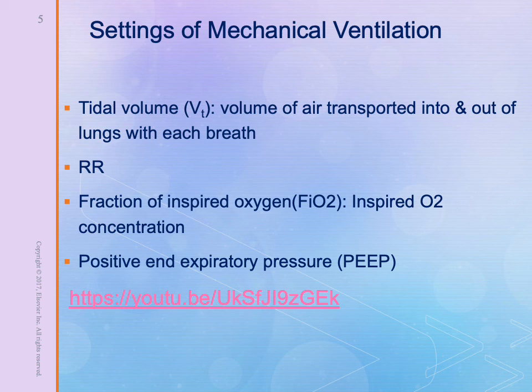The last setting that we will focus on is positive end expiratory pressure, or PEEP. It is the amount of positive pressure that is applied during exhalation, during the expiratory cycle, to keep the alveoli open and improve oxygenation. 5 centimeters of water is typical, but some patients, like those with respiratory failure, may need higher levels. And there is a link on the bottom of the screen that will go over some of the ventilator settings in more detail if you would like to view that on your own.